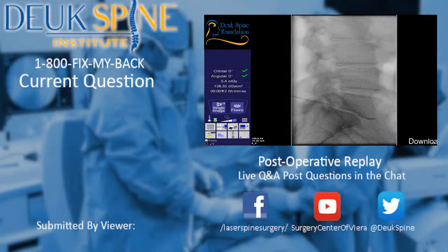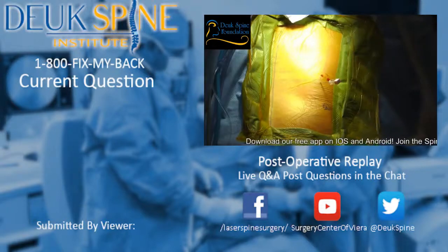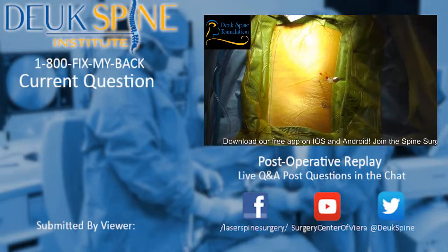So will a good fusion work to get rid of back pain? Yes. Will a good fusion work to get rid of discogenic neck pain? Yes. But why would you want to do a fusion when you could just do the endoscopic laser surgery, a very fast recovery, minimal pain? This patient will take probably Tylenol for pain, and that's it.